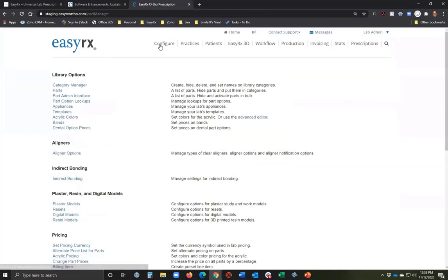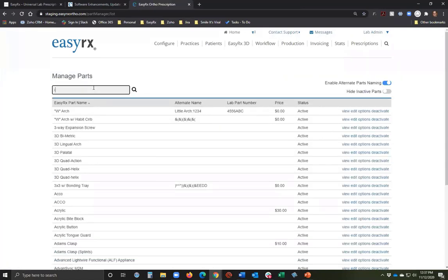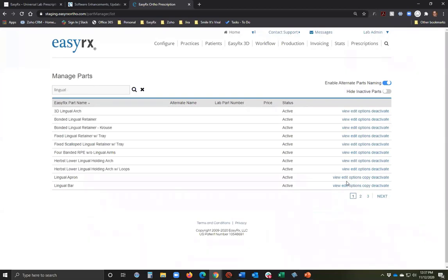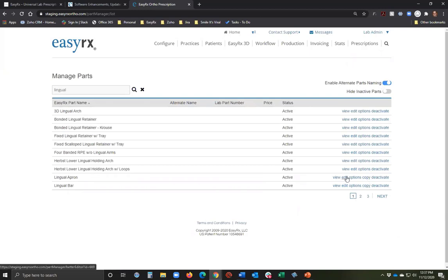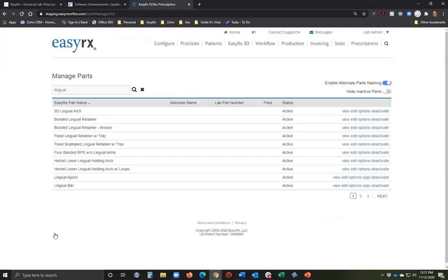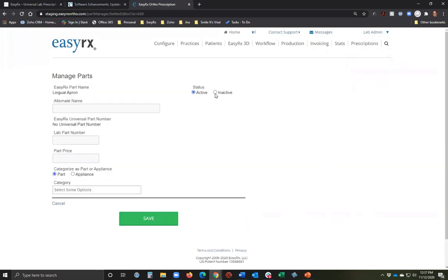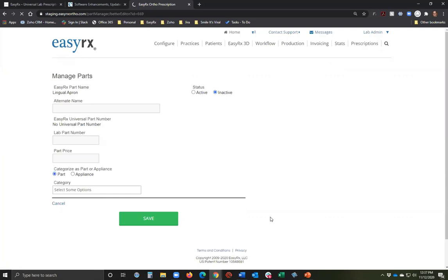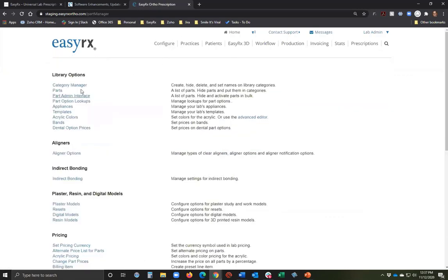After logging in as a lab, you can go to 'Configure Parts' to review the parts. There's a slider bar to enable alternate part naming — if that option is enabled, you can give a part a different name. Or, if you don't offer that part, you can mark it as inactive, and customers will not be able to select it when sending a prescription.